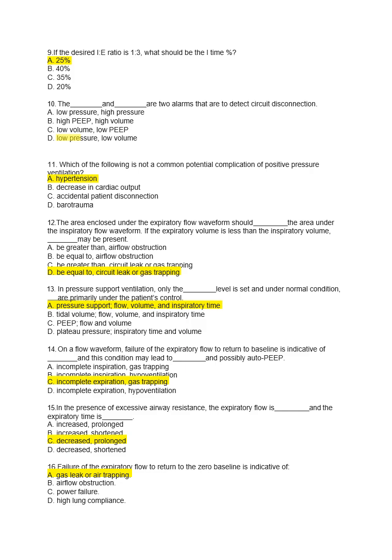As already discussed in an earlier question, when the expiratory flow is not coming back to the zero baseline, it indicates that either there is a gas leak or a circuit leak, and some air has leaked through a circuit disconnection or a circuit leak, or otherwise some air is being trapped within the patient's respiratory system or the alveoli, and as a result the complete volume of air that has been given during inspiration is not received.